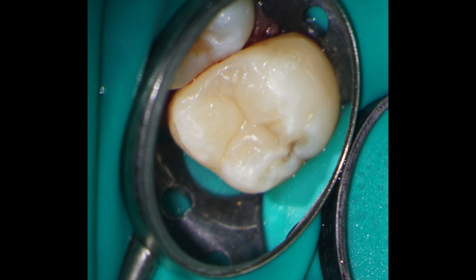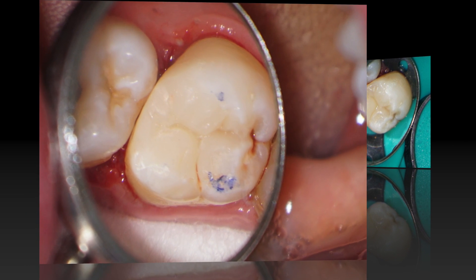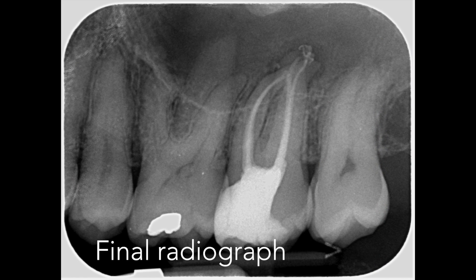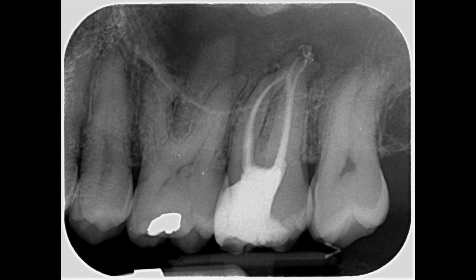Here you can see the finished composite with the matrix still in place. I've now removed the matrix and carried out some polishing. Time to check the contacts before taking a final periapical radiograph — this tooth probably won't need to be crowned. The final radiograph shows excellent coronal-apical seal and you can see that the sealer has been carried all the way down to the apex and has puffed through some lateral anatomy at the apical part of the root canals.